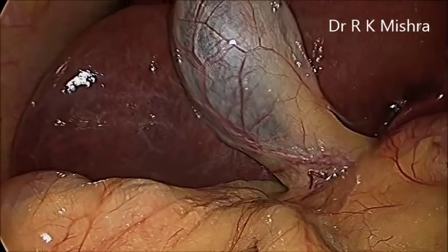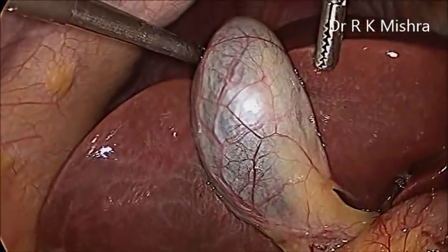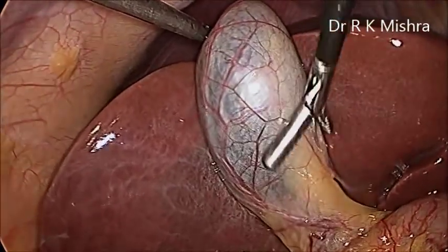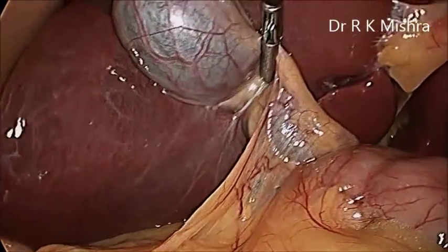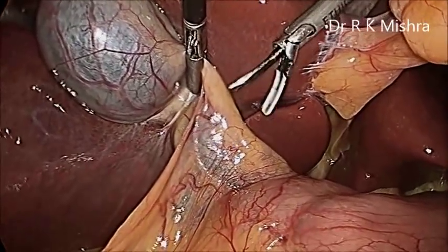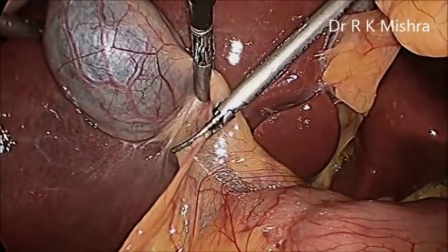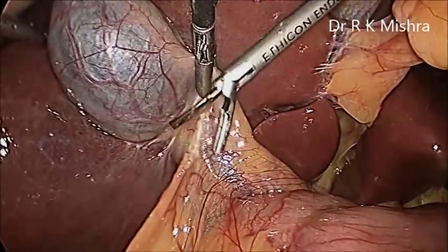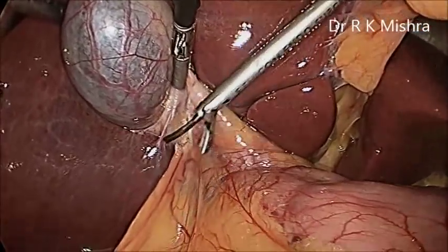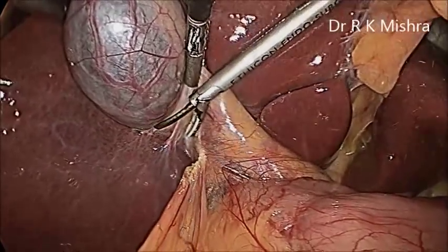Here the harmonic scalpel is used, and we have also used the Mishra's knot for the ligation of the cystic artery and cystic duct. Cystic duct was ligated. This is the left hand instrument, which is holding the Hartmann pouch, and the right hand has the harmonic. If you keep the silicon jaw of the harmonic towards the gallbladder, then vibration cannot transmit to the cystic duct or the gallbladder, and there will be no chance of thermal conduction or injury. So the vibrating jaw of the harmonic should be visible.